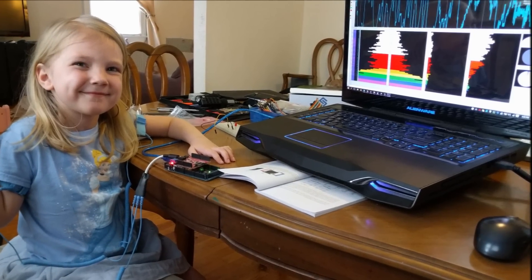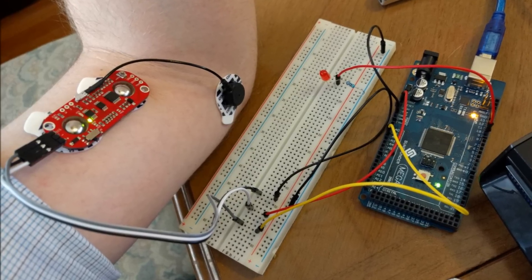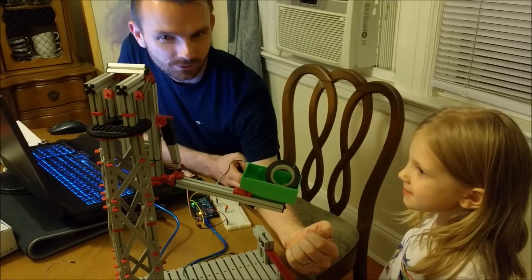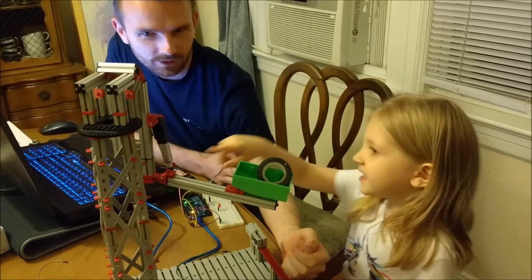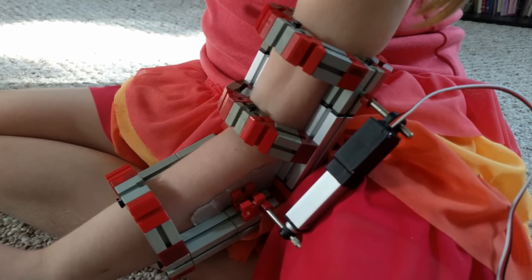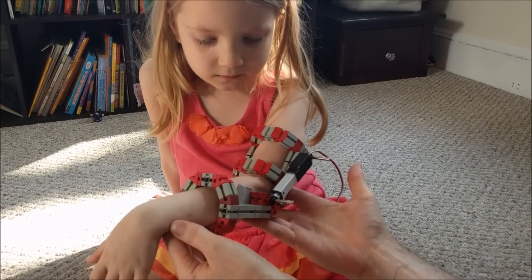When she sends a signal to her bicep from her brain, we're going to be able to pick that electrical signal up through a muscle sensor. It's going to trigger the actuator to pull her arm up, and when we receive a signal in her tricep, that's going to cause the actuator to push her arm back down.